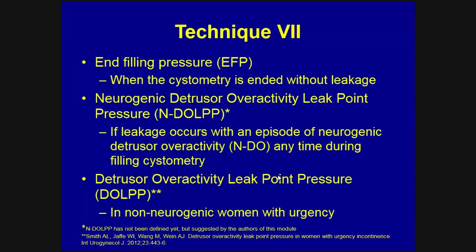Sometimes, or in many cases, cystometry is ended without leakage, and the authors of this teaching module have decided to mark this point as end filling pressure, as it was shown in many studies. There is a neurogenic detrusor overactivity leak point pressure which has not been defined yet. This is something that we propose as a new terminology.